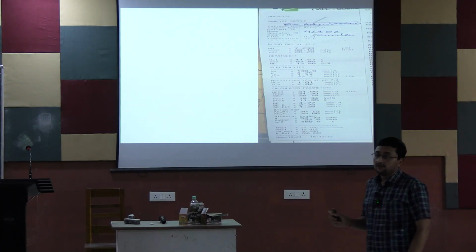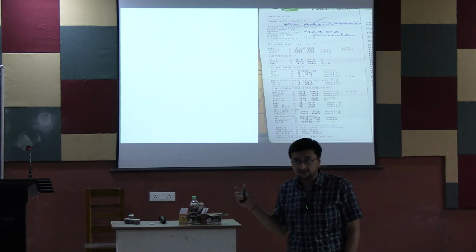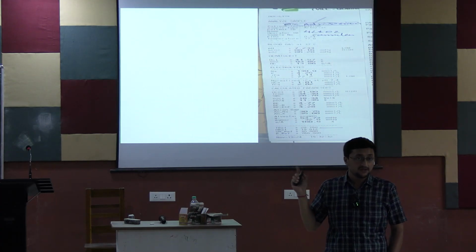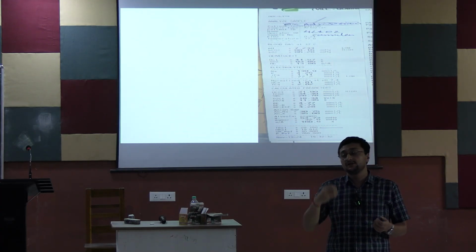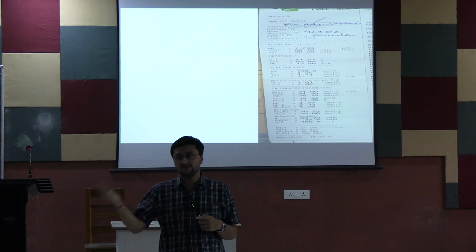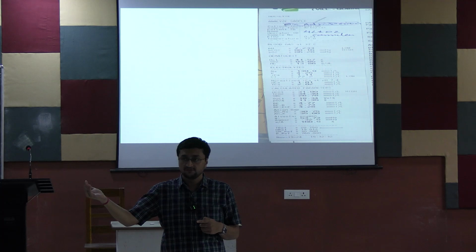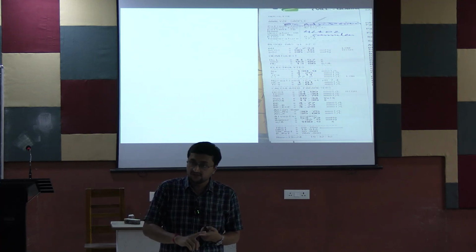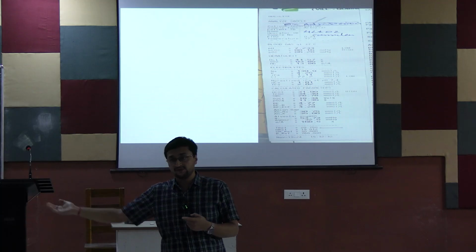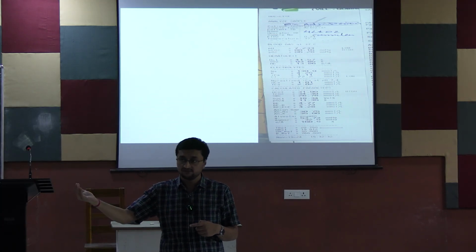Because this patient, the ABG যখন নেওয়া হয়েছে পেশেন্টের, তখন patient was on 4 liter of oxygen, right? So if you are giving the patient 4 liter of oxygen or 5 liter of oxygen, then definitely PO2 will rise. When a patient is in room air, compared to those patients getting oxygen, the PO2 definitely will rise, right?